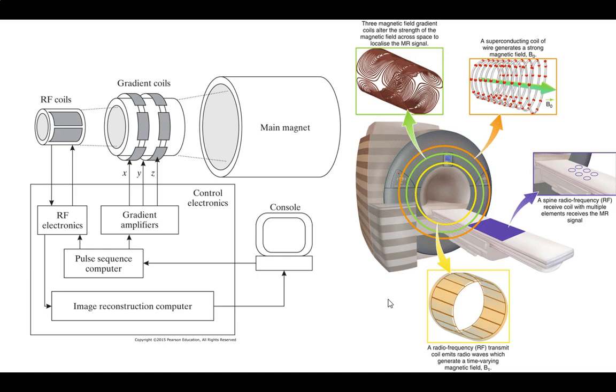All right. So MRIs, how are they generated? If you notice, we've got the RF coils on the innermost area. That's the really important area because you need that RF coil as close to you as possible. We also want the main magnet as far out as possible because that's going to create an even field. And the more even that field is, the easier it's going to be to read things off accurately, because any deviation in it is going to look like a deviation in the gradients, which are important to us.